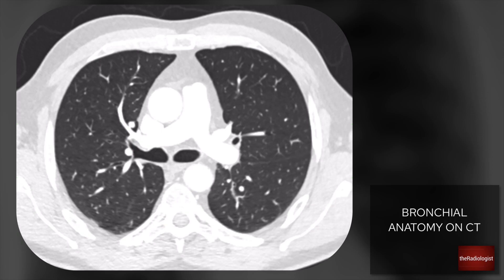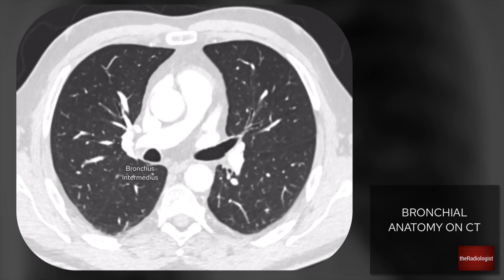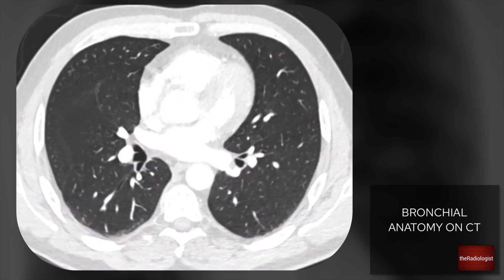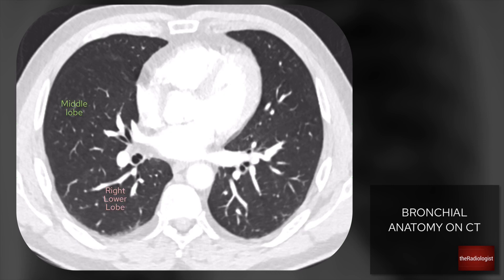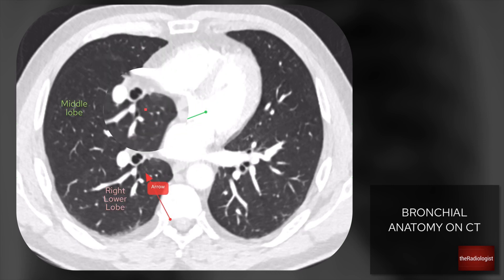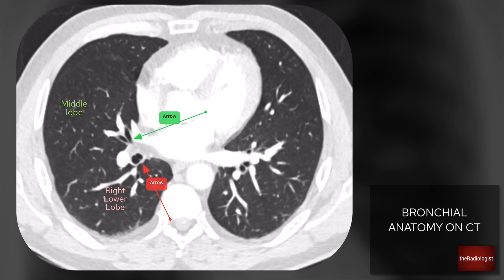Once that right upper lobe bronchus has come off, the airway is then called your bronchus intermedius. That's going to split into two: your middle lobe which goes anteriorly, and then your lower lobe which comes off posteriorly. So this here is your bronchus intermedius, and if we come down we can see your middle lobe airways coming off here and your right lower lobe airways coming off here.